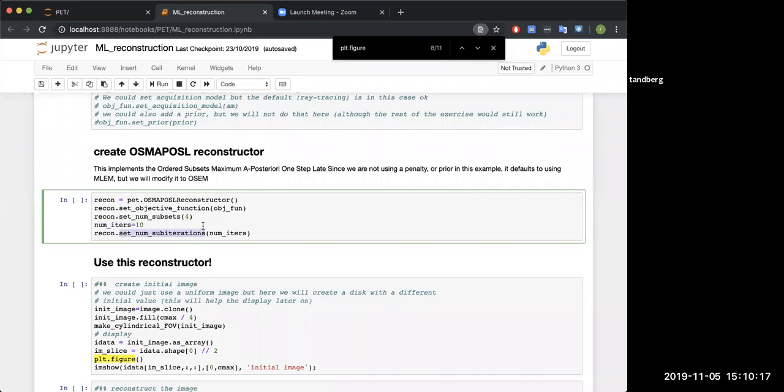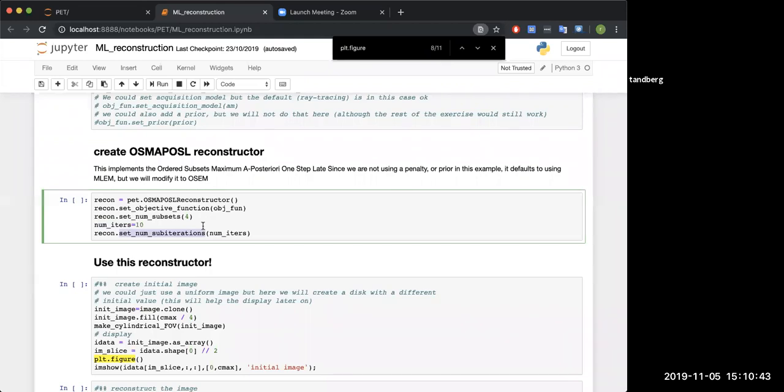Bear in mind the difference between an iteration and a sub-iteration. A sub-iteration is each time we run an update. An iteration will be each time we completely go over our data. So if we have four subsets, an iteration will be every four, whereas a sub-iteration will be every single time. In MLEM, every iteration is one sub-iteration. If I use OSEM with four subsets, every iteration is four sub-iterations.